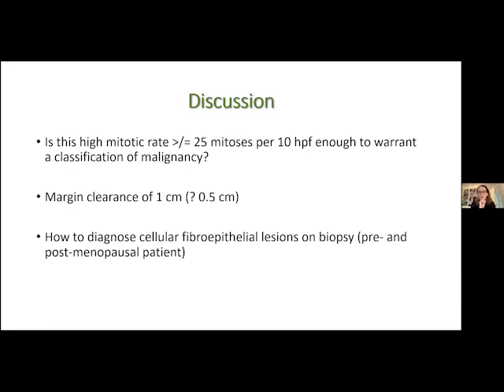If I see, though, more features other than hypercellularity, such as a few mitoses, more marked hypercellularity, or any other features that may be indicative of a phyllodes, then I'll give the differential of a cellular fibroadenoma and the phyllodes, and that it should be excised. But most of them probably fall into the former category where they're more likely a cellular fibroadenoma and they can be watched. And if the lesion grows at that point, they can be excised. That would be my approach.